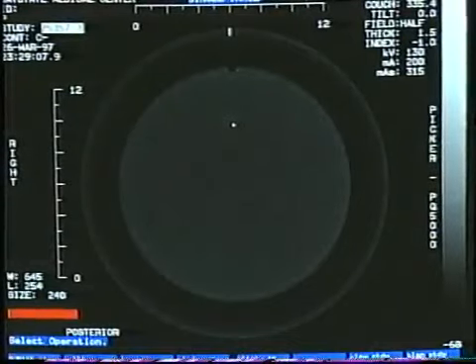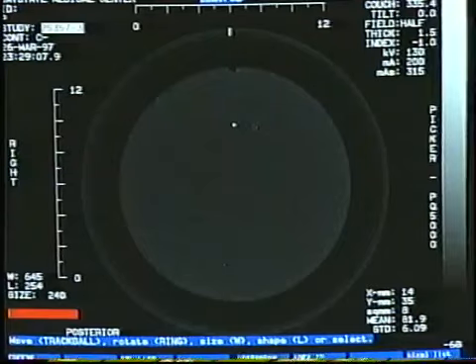All Catphan models use a very dense tungsten carbide bead to create a point source signal for the modulation transfer function, or MTF, plot. This patented bead design eliminates the errors which can be caused by misaligned wires. The reason we moved away from the thin wire as a point source to a small isolated bead was because a bead is much easier to align. We do not have artifacts from alignment such as streaking.